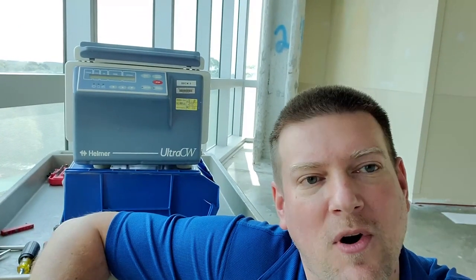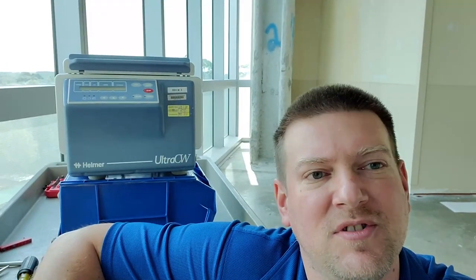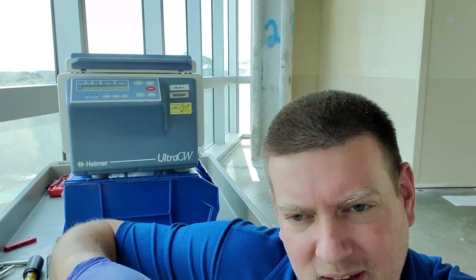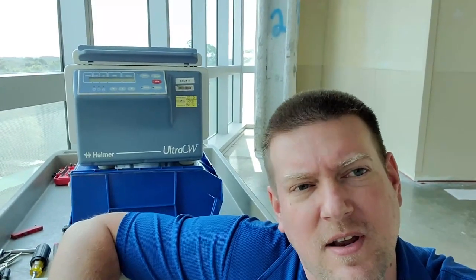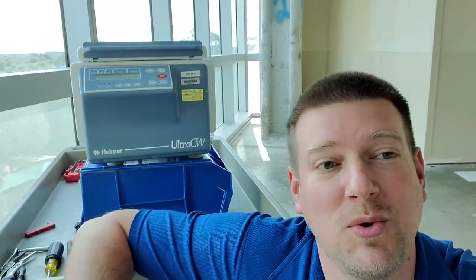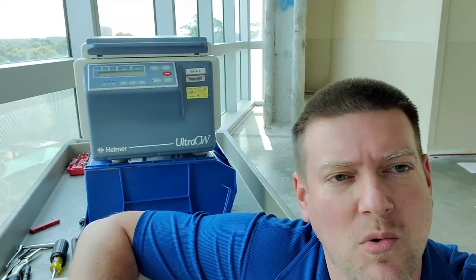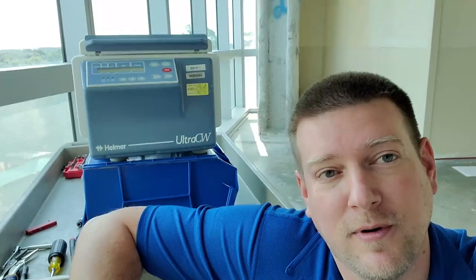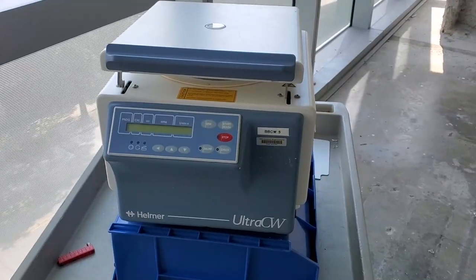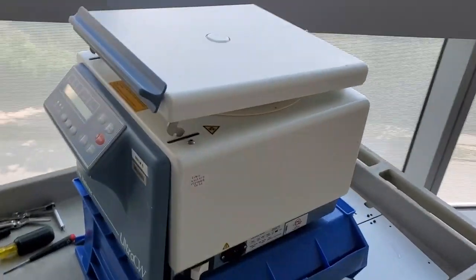This is the Helmer Ultra Cell Washer Ultra CW, and it's been giving a lot of tach errors and doesn't want to spin. This is a perfect opportunity to show what's going on with it and what we can do for regular maintenance.